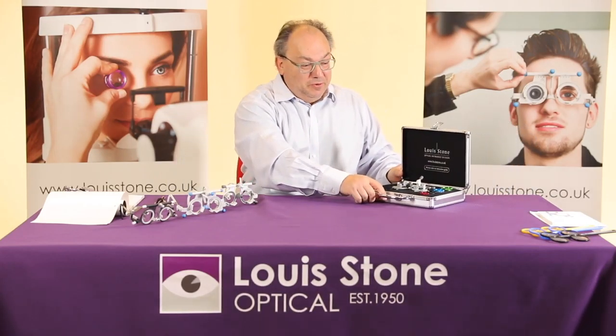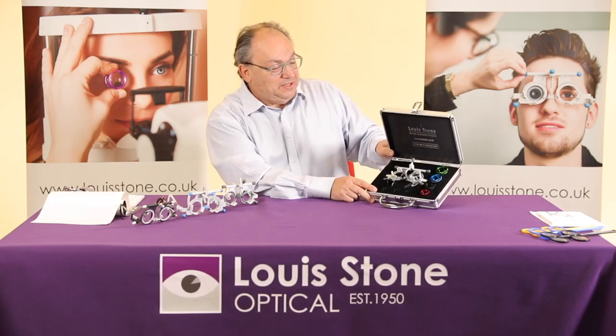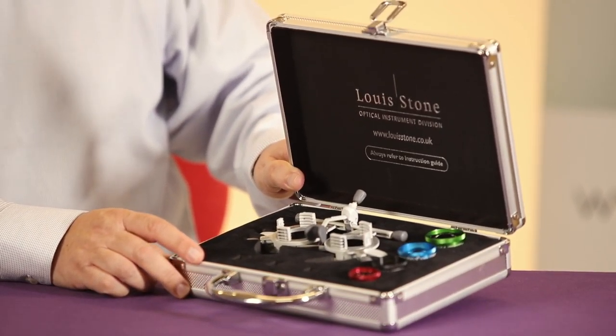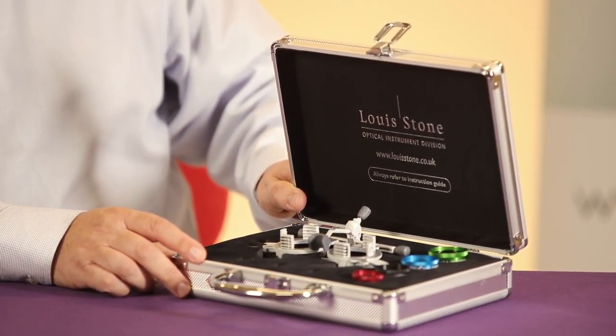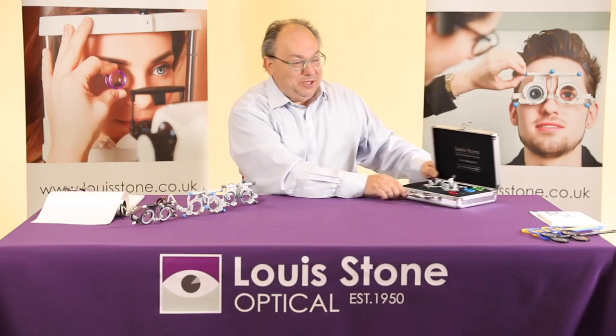For those of you who want the UB6, we've now got an aluminium case specially for it, and this will also take four slit lamp lenses. You can see there are four different sizes it will take. So for the future, if you buy another slit lamp lens in a few years, you've got this storage case and you can also fit in the UB6.